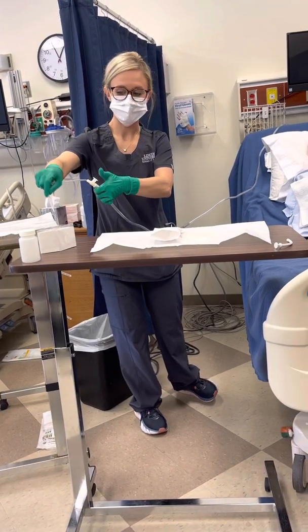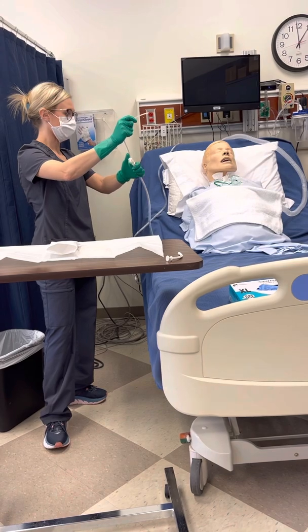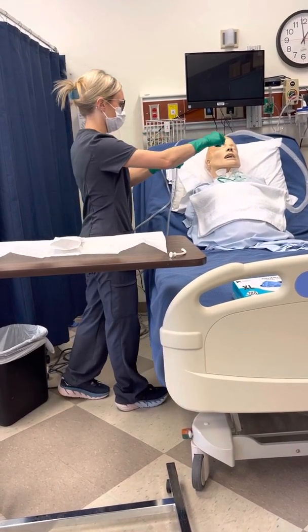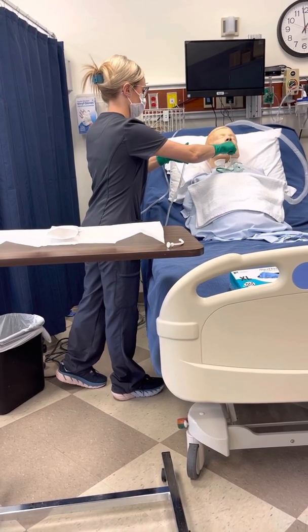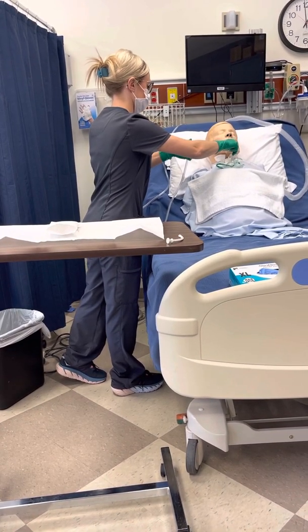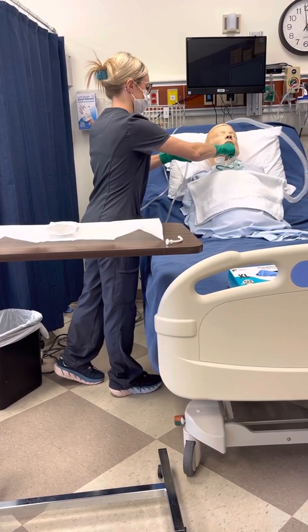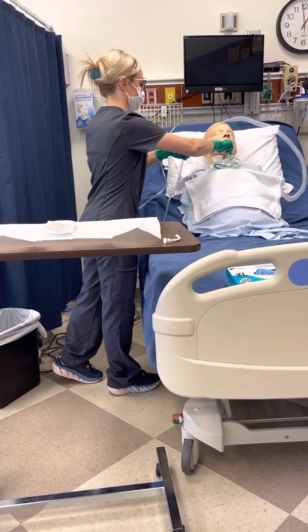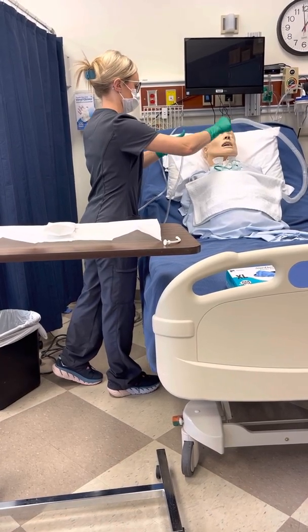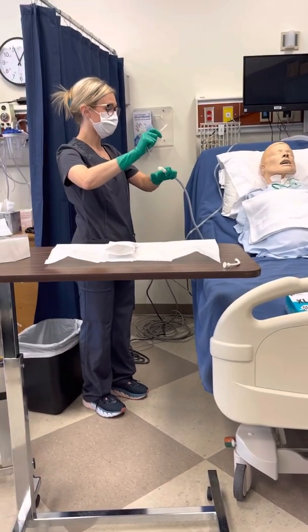Making sure to clean it out, giving my patient at least 30 seconds to a minute to breathe. I'm going to go again until my patient either coughs or I meet resistance. Okay, met resistance. I'm going to do intermittent suctioning again for no longer than 10 to 15 seconds. Okay, and at this time, there are no more secretions.